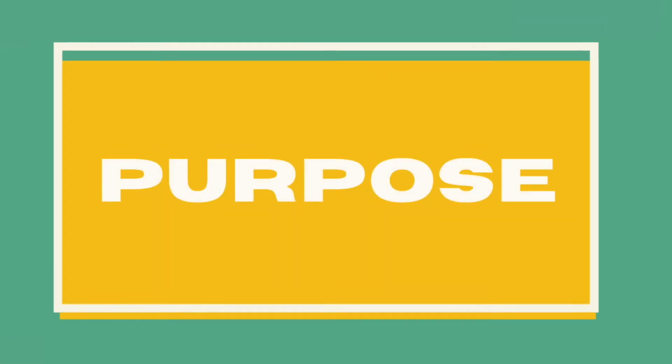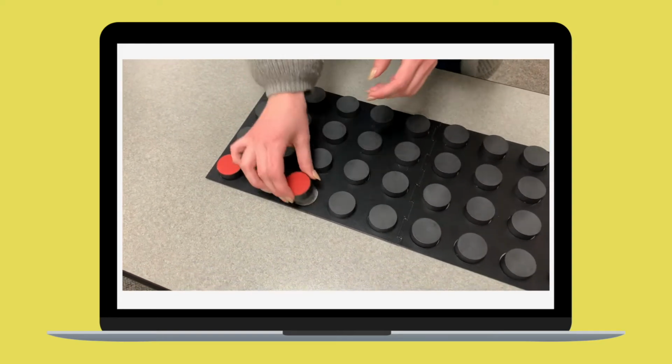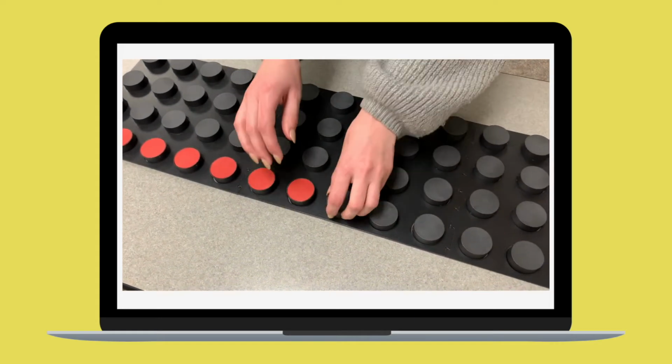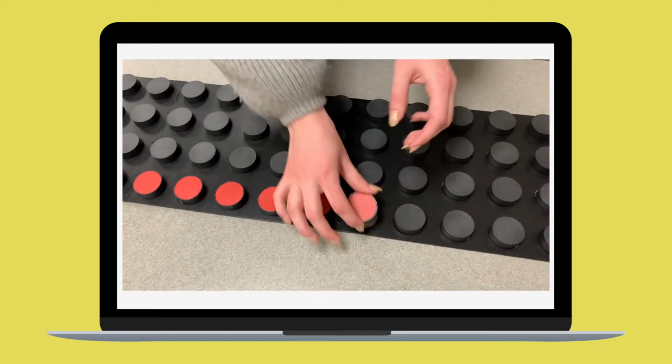Purpose of assessment. The Minnesota Manual Dexterity is a standardized test for evaluation of a subject's ability to move small objects in various distances. It is used to measure a subject's simple but rapid eye-hand coordination, as well as arm-hand dexterity.